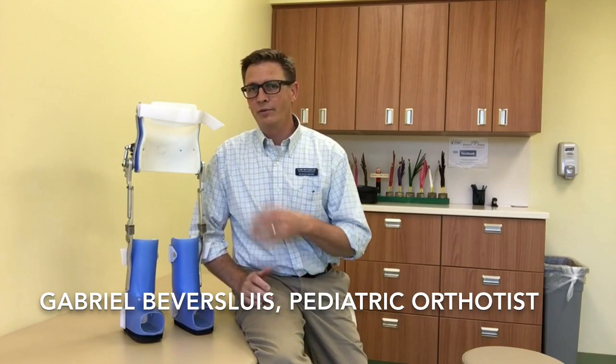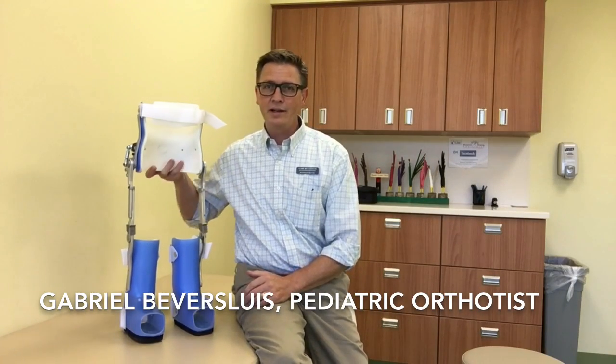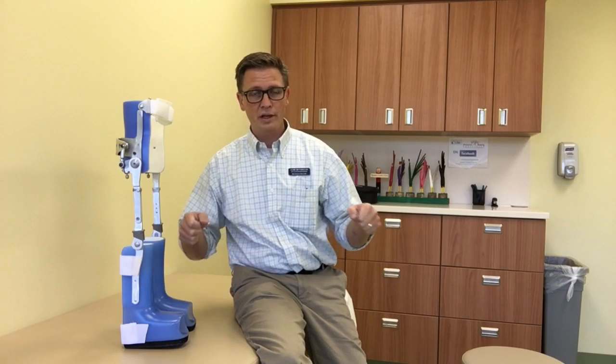I'm Gabriel Beversluis and I want to talk to you today about a reciprocating gait orthosis. This is an orthosis for children who are paralyzed below the waist who typically spend most of their time in a wheelchair and perhaps do some assisted standing or weight bearing with either CAFOs or HKAFOs, but tend to need their hands and arms quite a bit for stability and to hold themselves upright.